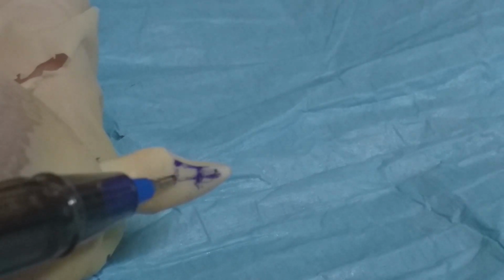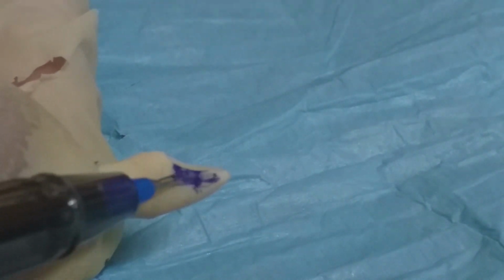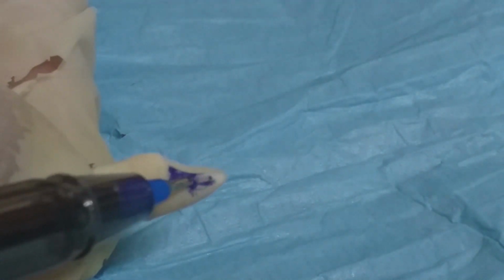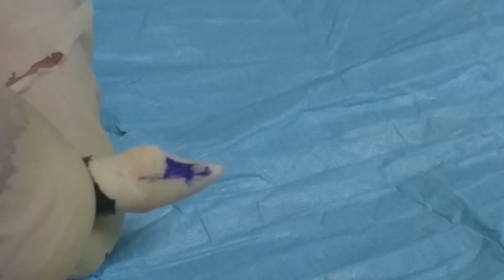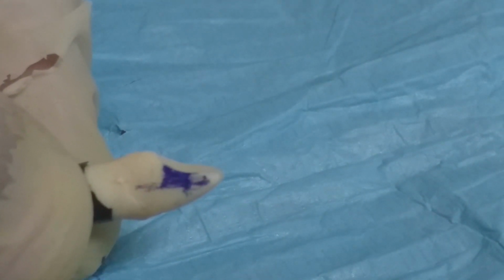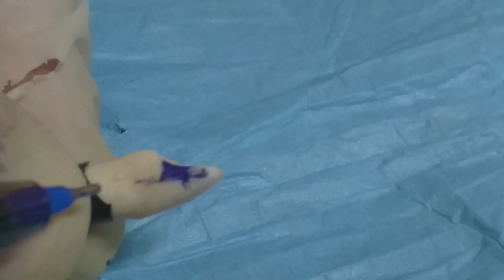The incisal wall outline will extend to it, and the gingival wall outline that we drew, the lines we drew will extend in the proximal surface until they reach the proximal line that we drew, like this.